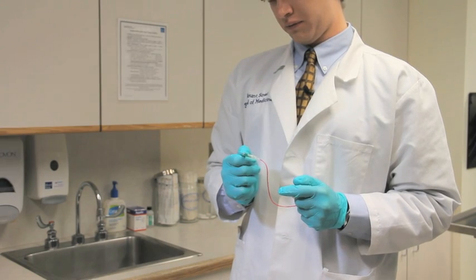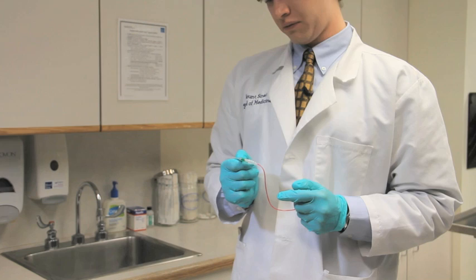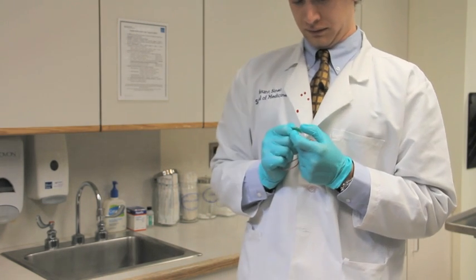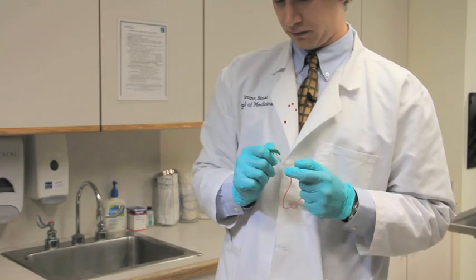With spring retraction needles, a common error is to examine the needle after the blood was drawn, realize there is a button, and press it. Doing so can result in micro droplets of blood splashing at your open eyes, mouth, and face.